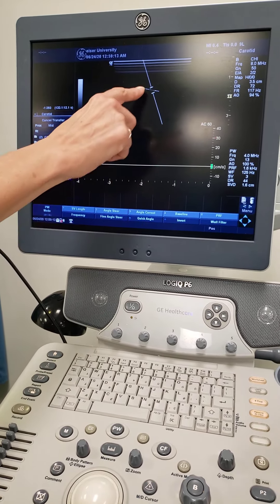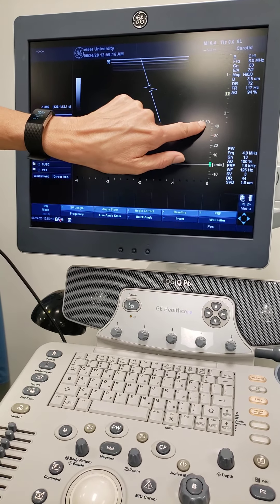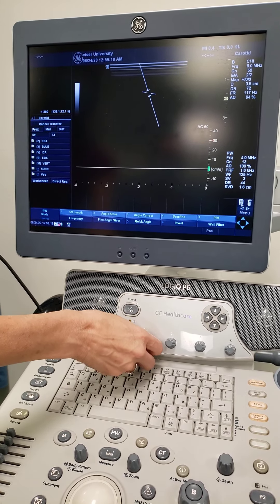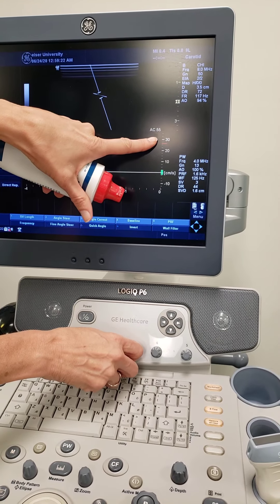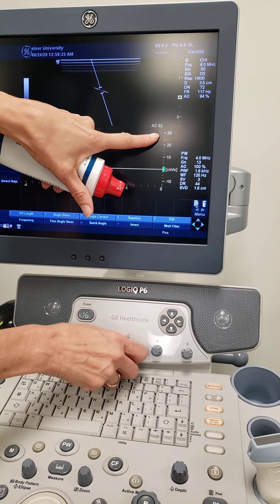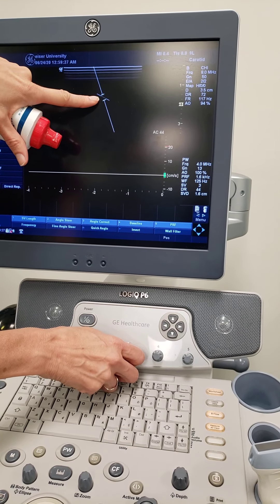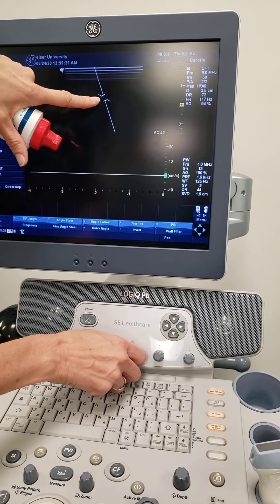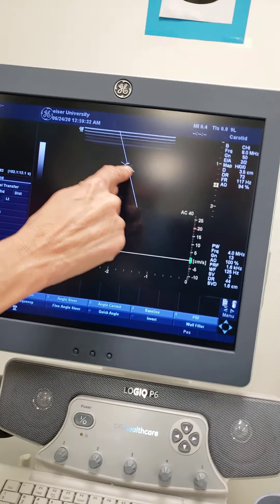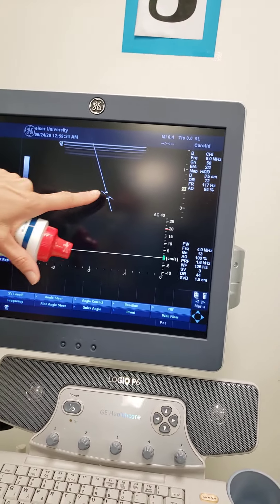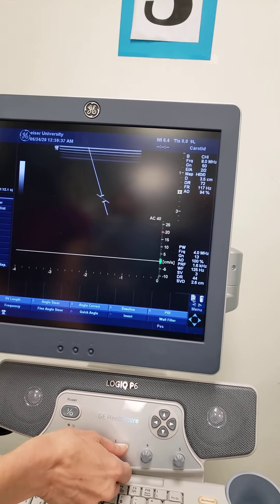Steer angle — angle correct is the protractor. See, it's set at 60. When I change this, see the number changing here? It's making the angle that you want. So if I wanted a 40-degree angle, it's saying if you line up the vessel wall with this line, then you'll be at 40 degrees. But not on the vessel wall?